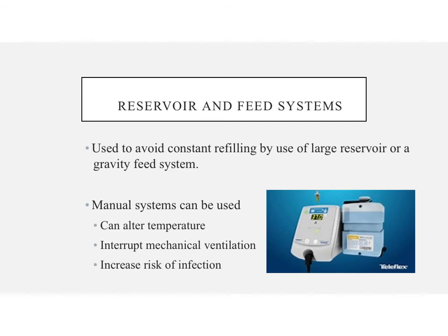They do require constant checking to make sure that there is an adequate amount of water between the time that you're seeing them now and the next time you come to do a ventilator assessment. If you are not checking these systems, the humidifier can go dry, and that would put the patient at risk for airway burns and airway damage. Because remember, having a patient on a ventilator without humidification can do airway damage within minutes.